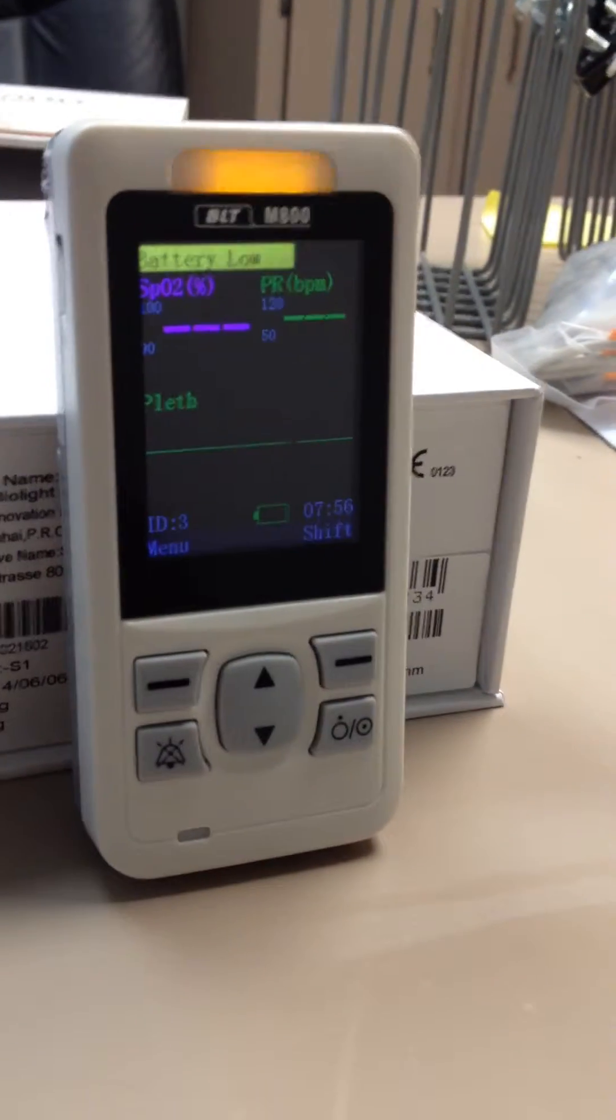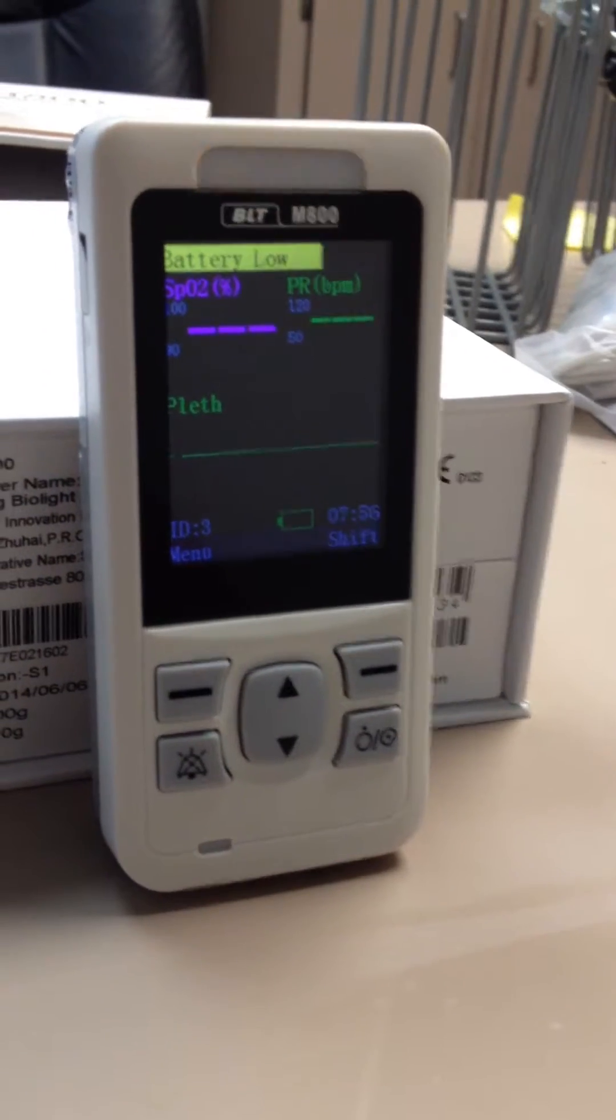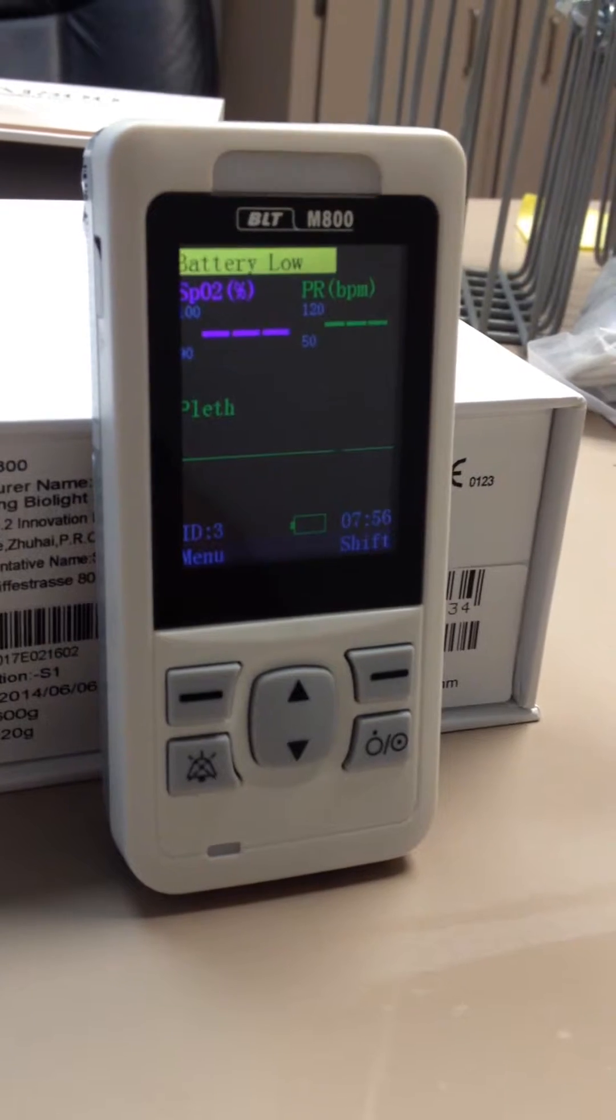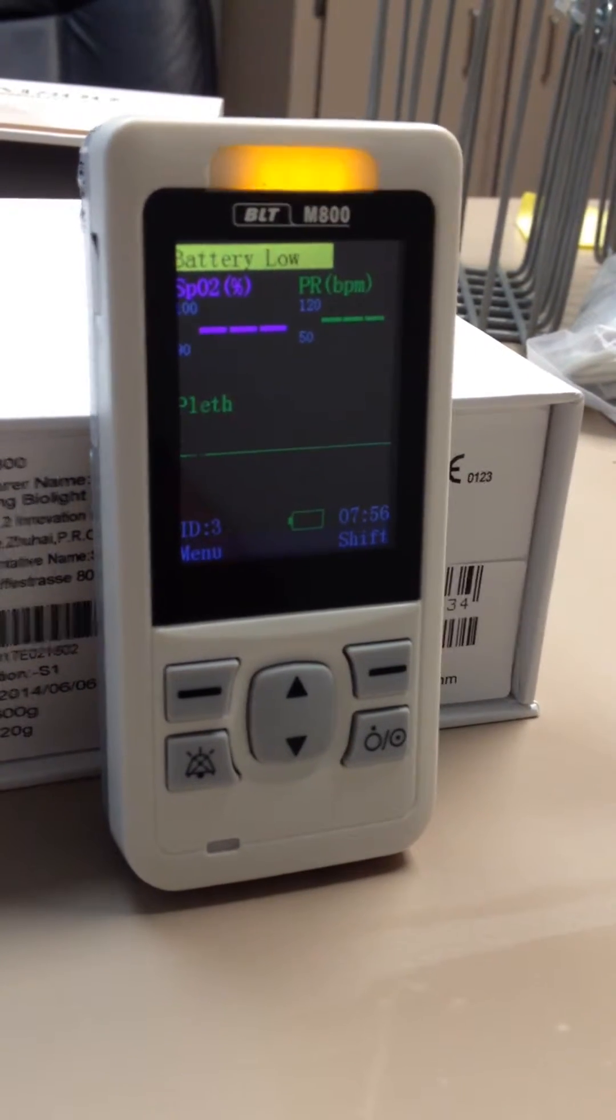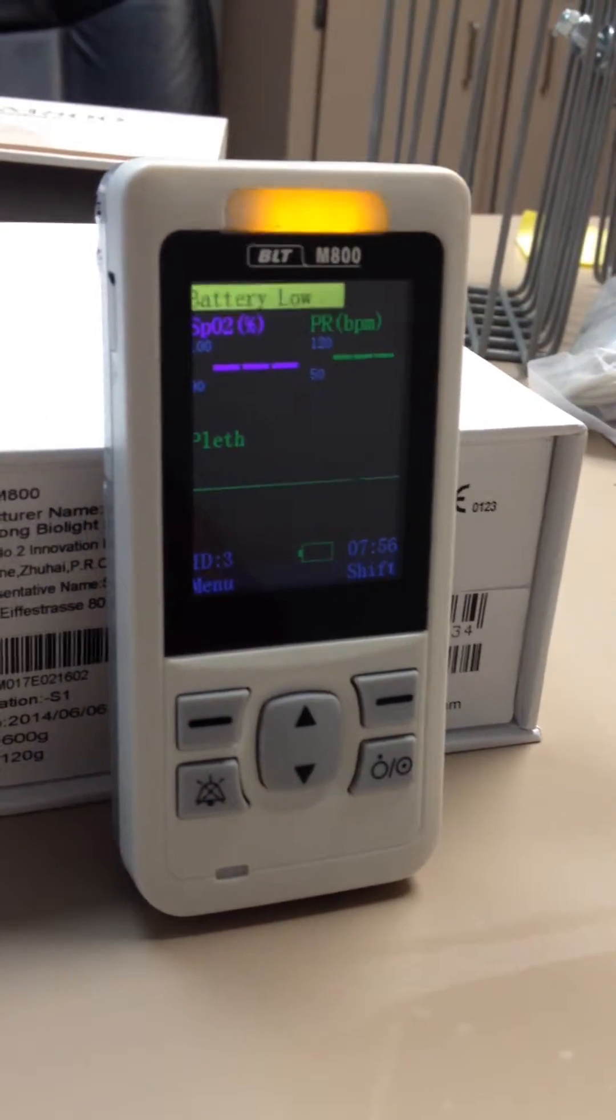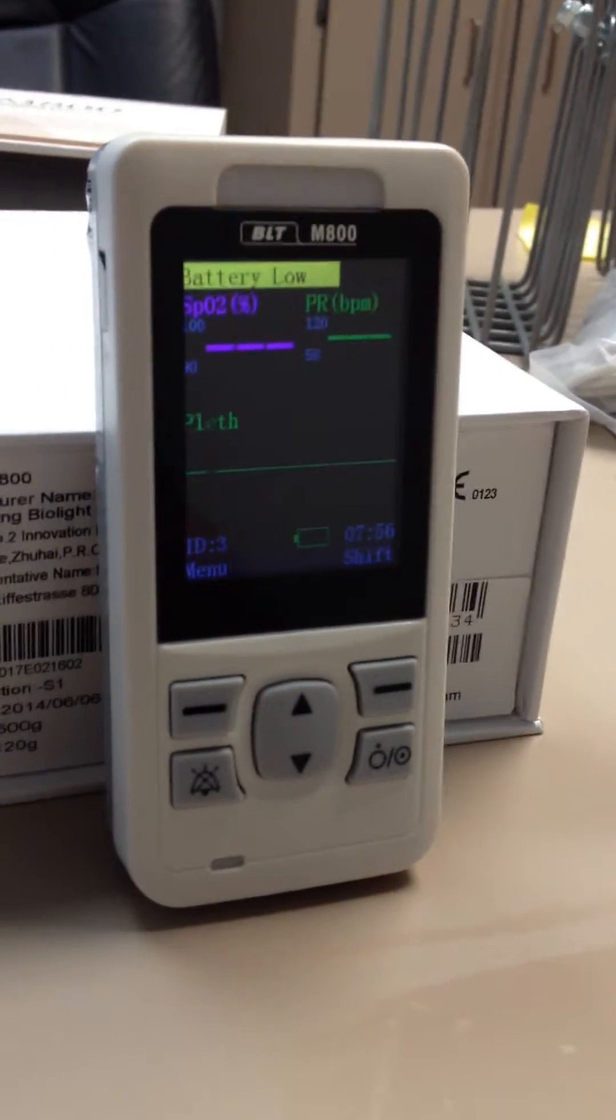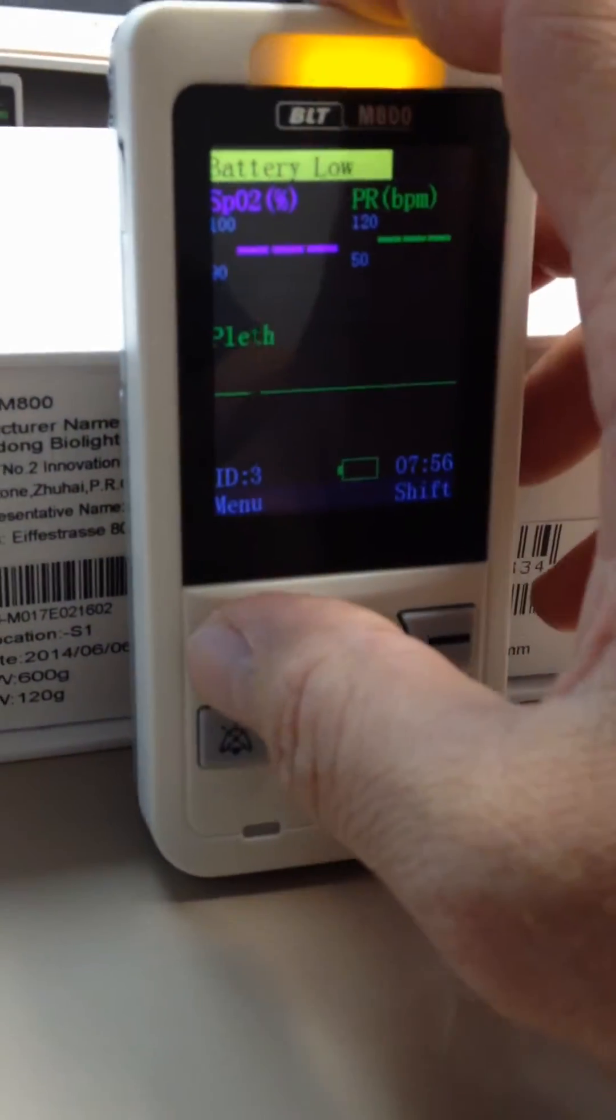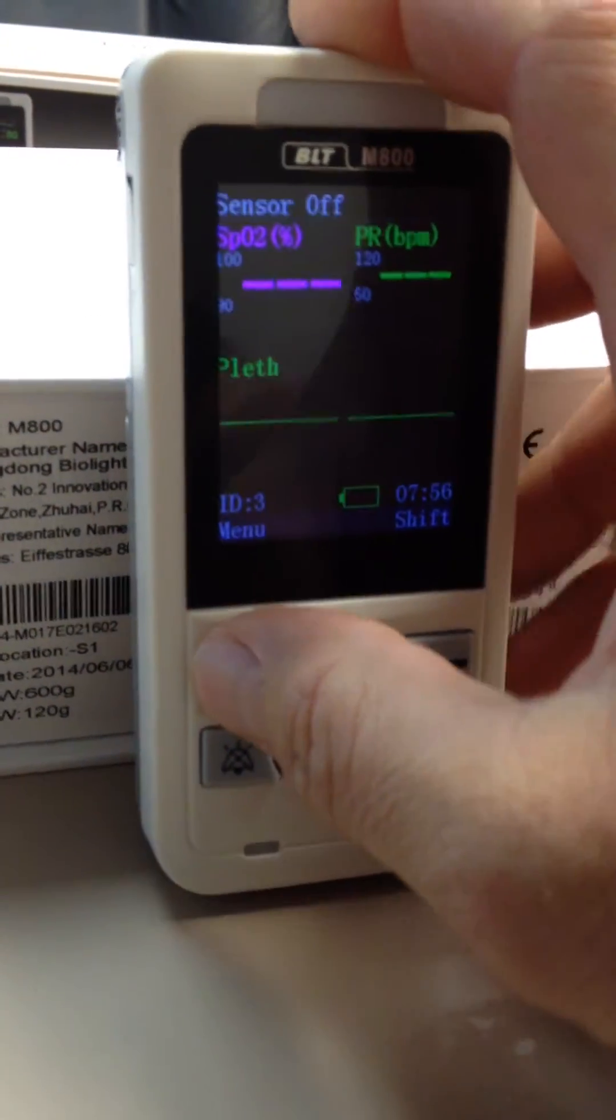In order to change the BioLite M800 handheld pulse oximeter from its default mode of Spot Check to Continuous mode, simply press the Menu button located here.